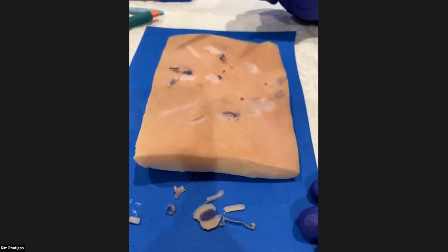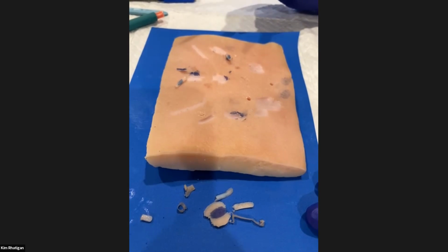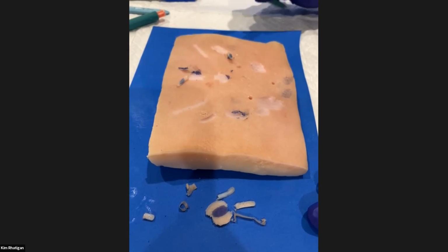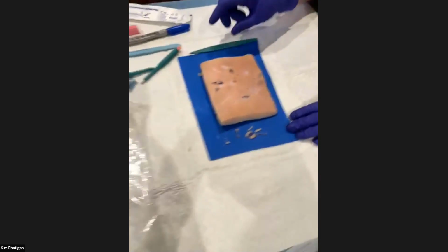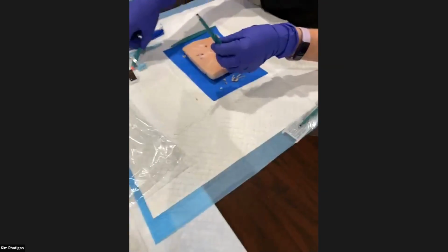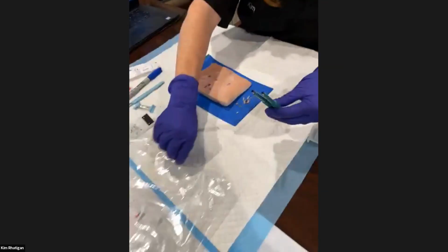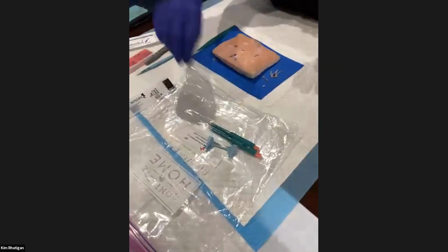Is there anything else you want to demonstrate, Dr. McClain? Well, you haven't labeled your sample yet. And you haven't put your sharps away. I haven't put my sharps away. So very important: all of these sharps, I should have a red sharps container, need to go in proper disposal. So I'm going to put them here for now.